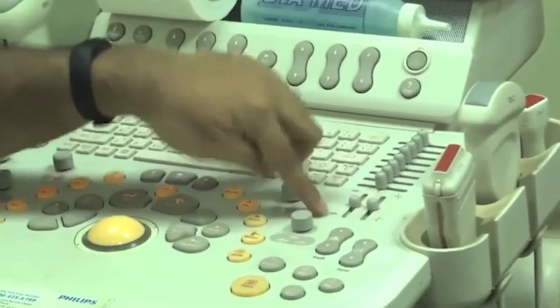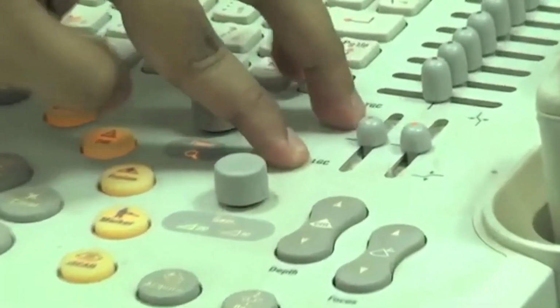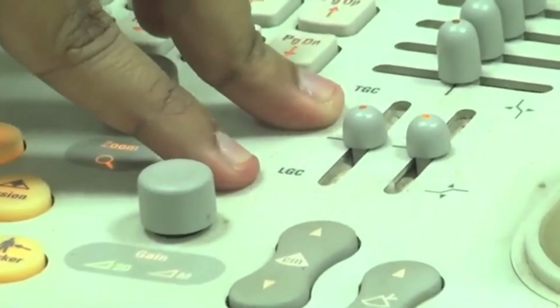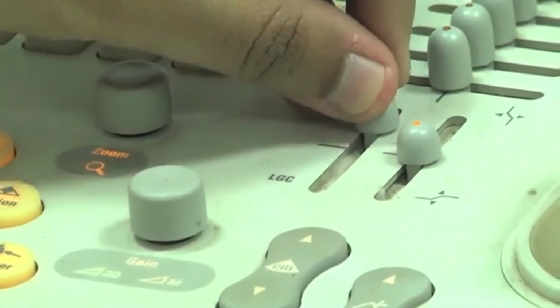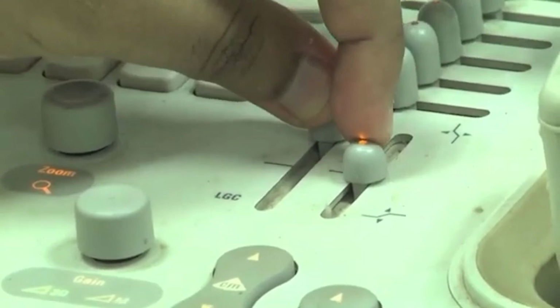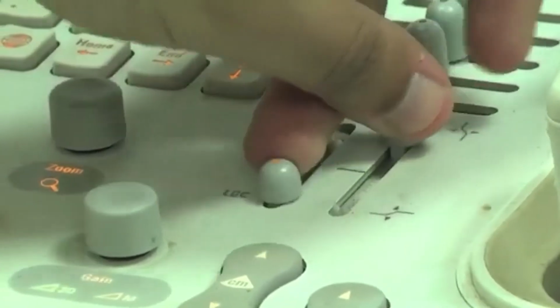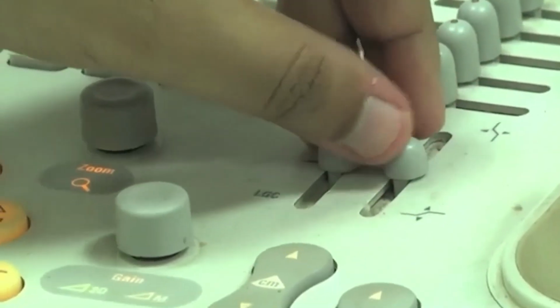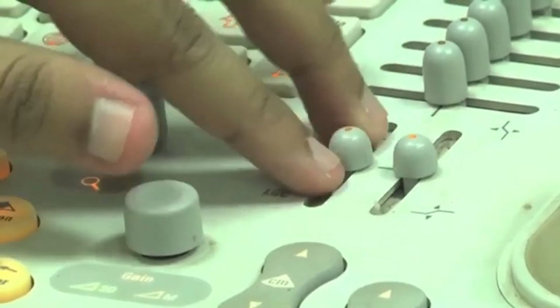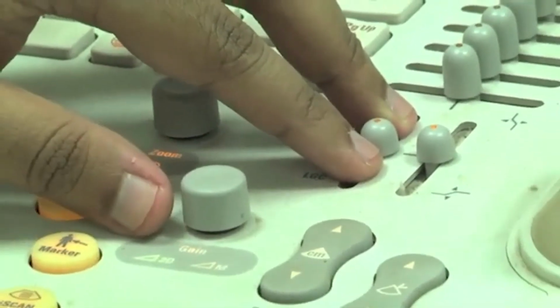The other one which I would show you is called LGC, or lateral gain compensation. This compensates the left-right kind of loss. Say that I want to amplify the signals coming from the left hand side and attenuate signals coming from the right hand side, I can make those changes over here. In general we keep unity amplification on both sides, and only in very specific cases do we use very selective amplifications.